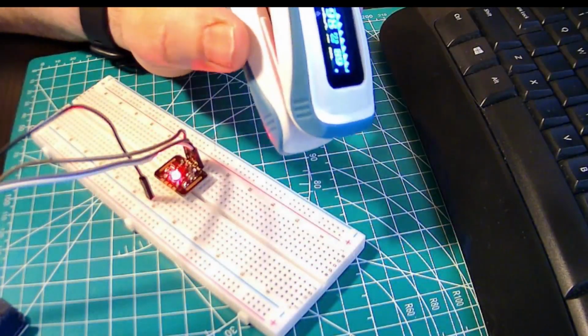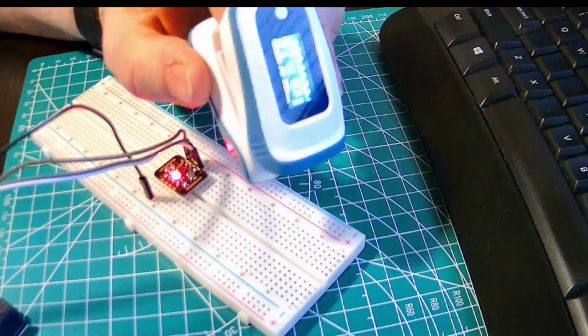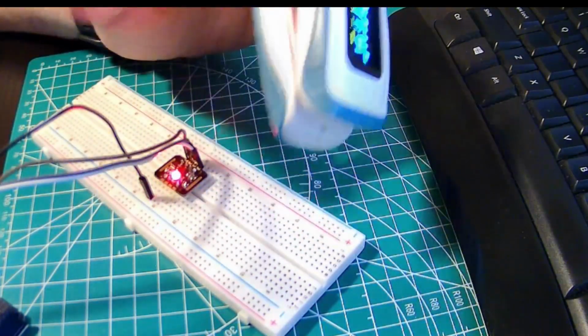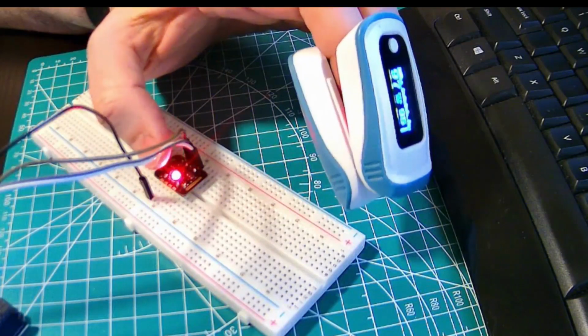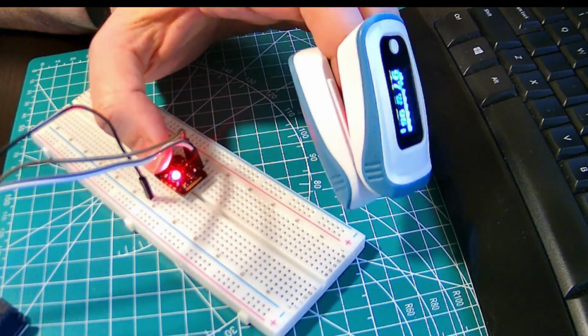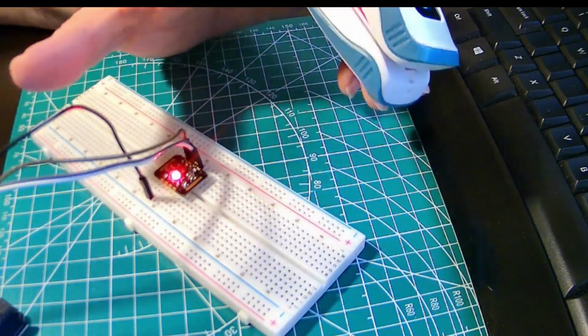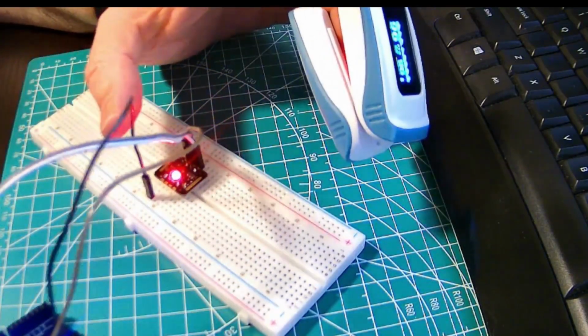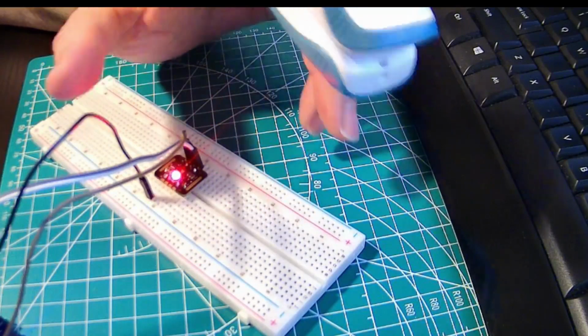Hello again, friends. Today we're looking at the operating principle of a pulse oximeter, and we'll be putting together our own solution using the MAX30102 pulse oximeter sensor and an ESP32. It's a neat little project that's interesting and has practical application.